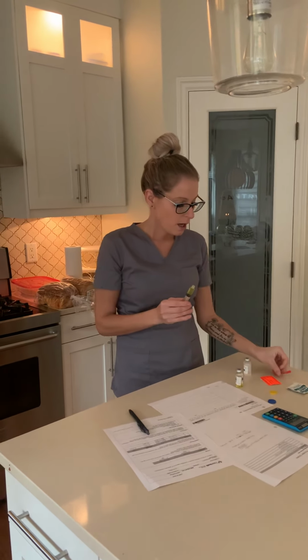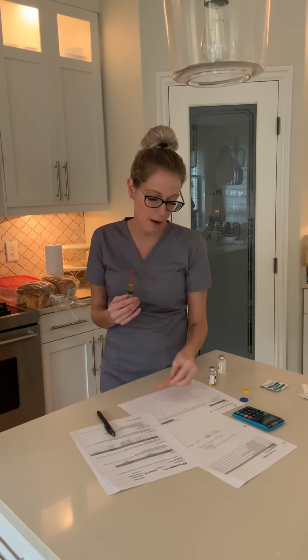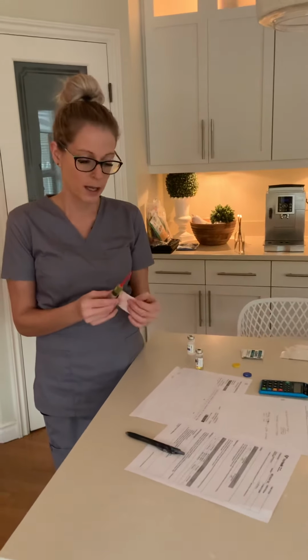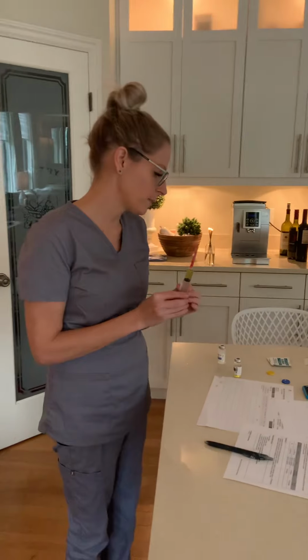Okay, or actually, I'd leave it on. But I would prepare a medication label with cefotaxime, I would say which patient this is, the amount of medication that was put in, and it was added by me. I would strategically place this onto the syringe so that it sat properly in the pump, and that way the nurses or anyone else that was caring for this patient knew what I was actually giving. So yes, the med label would go on as well.